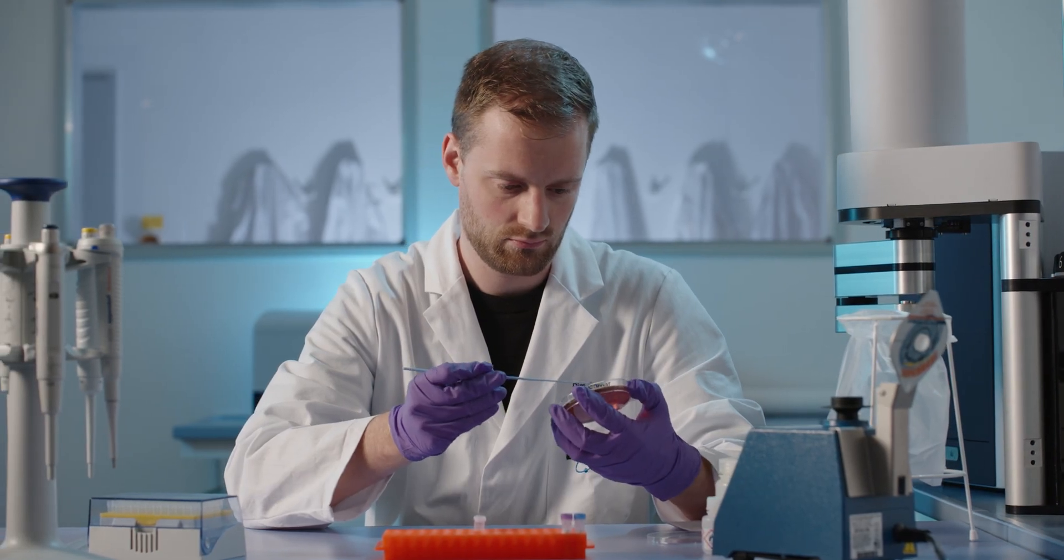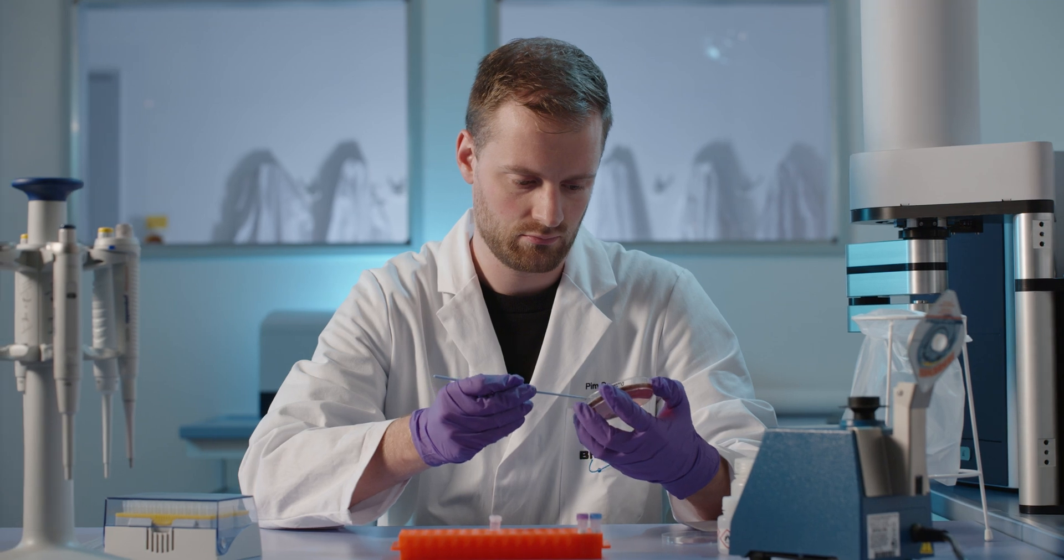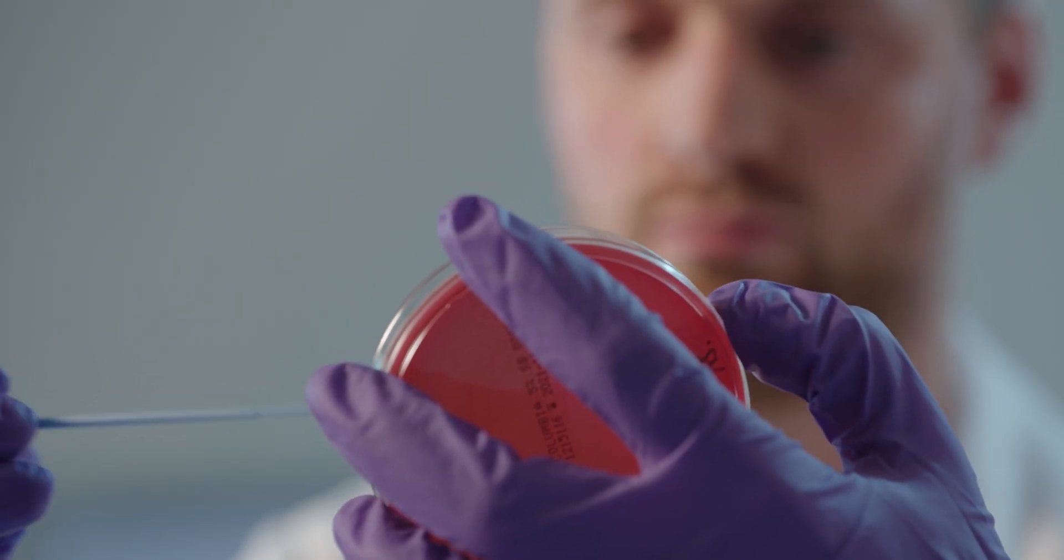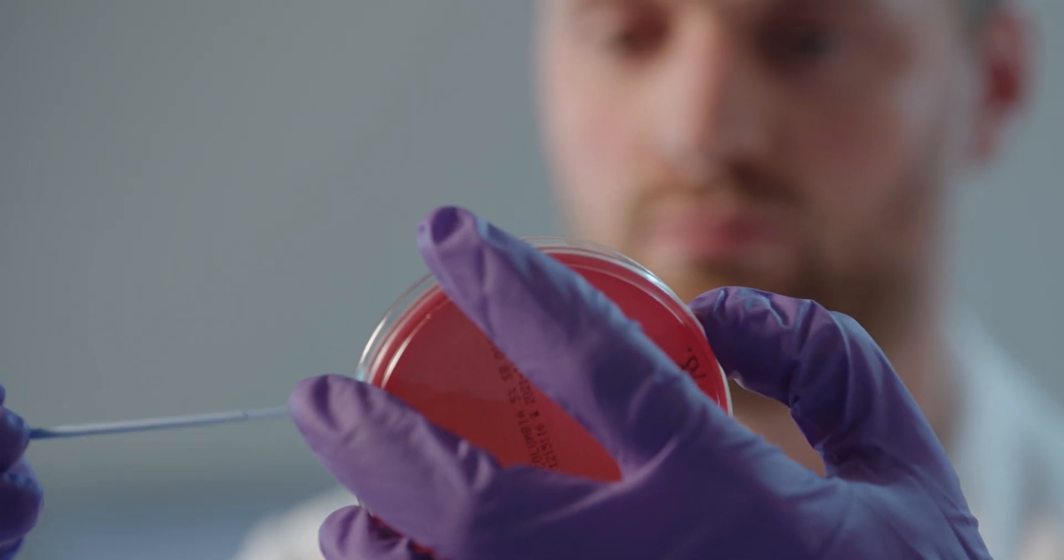Traditional strain typing technologies, however, are time-consuming and not accessible to every lab.